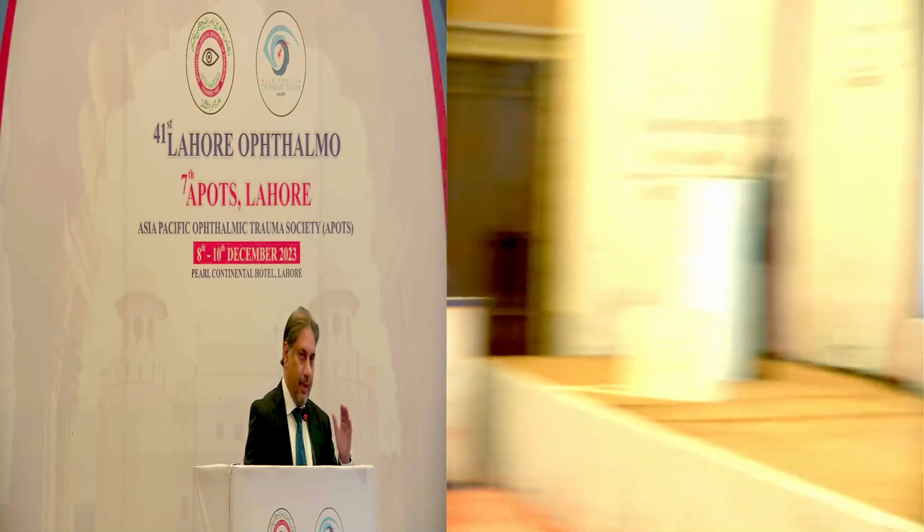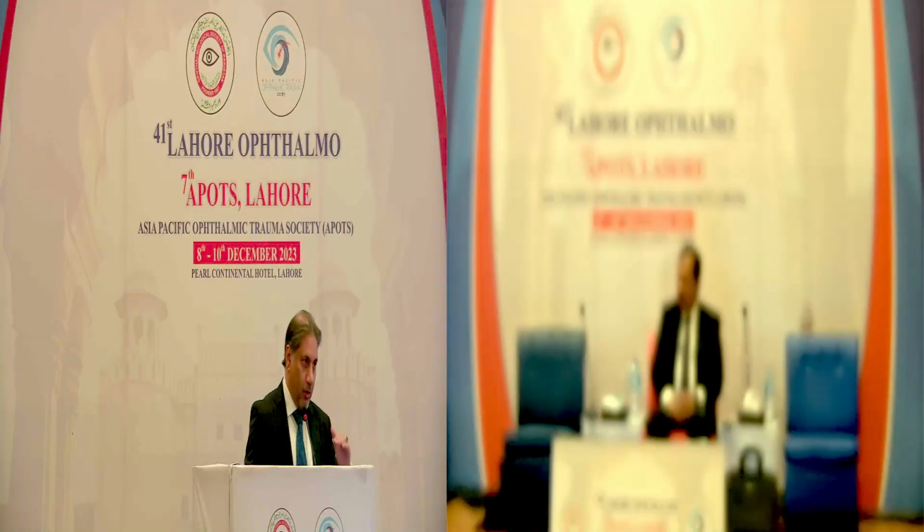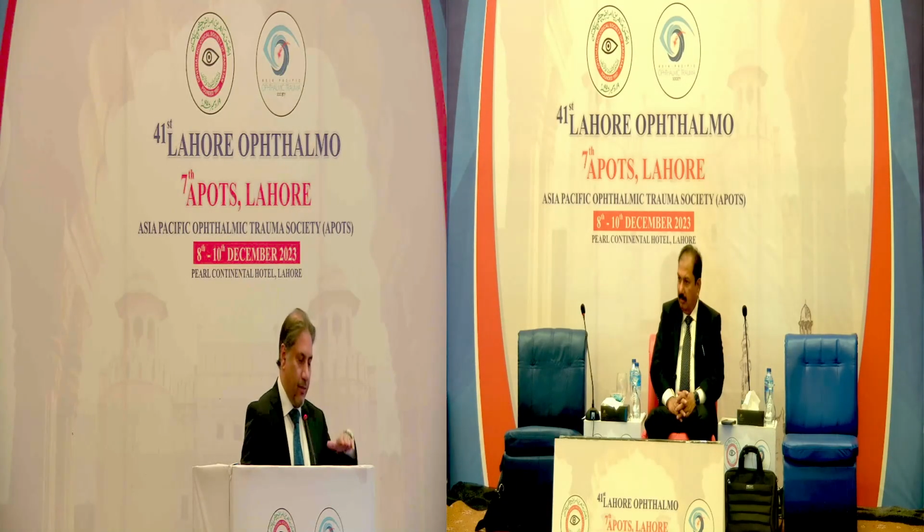One more thing I have to add in these cases is that when you have the entry point in the cornea, you have to save the host and graft junction. Because when you make an entry with a 2.5 or 2.8 keratome, you can damage the host graft junction, and then you can iatrogenically detach the Descemet's membrane. So this is very important.